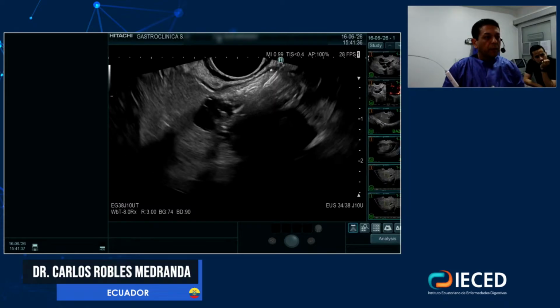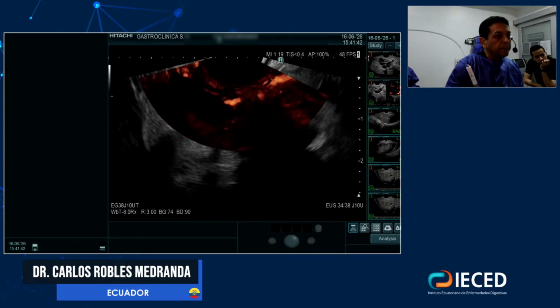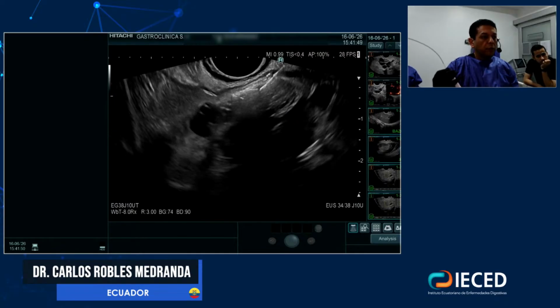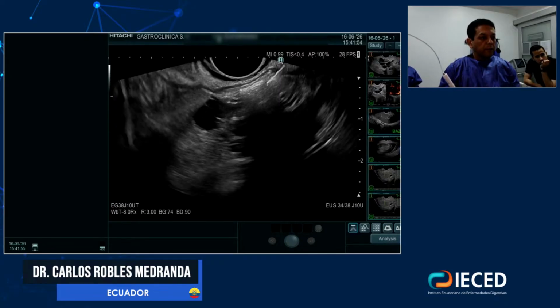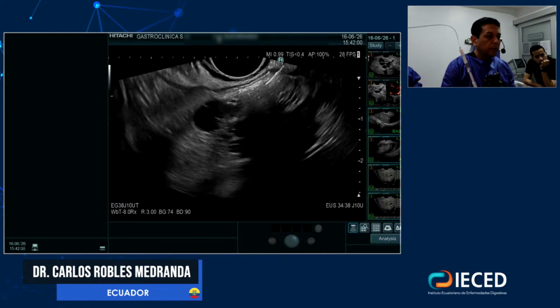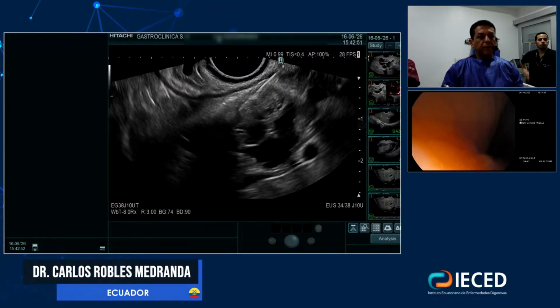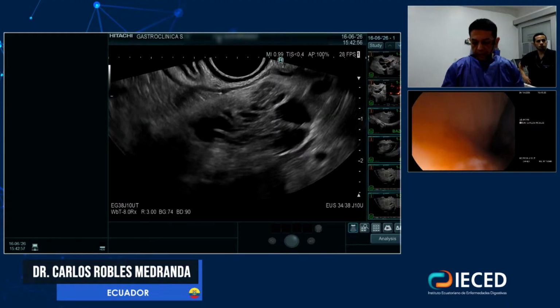Okay, now I am in another part of the cystic lesion. I will see again with the DFI. I'm okay. And now I will push. No, we are pushing. Okay. Now we arrive. Now I will remove a little bit. You can see here. So you need to feel that you have the tissue. Now I have taken 2 biopsies from the big cystic lesion.